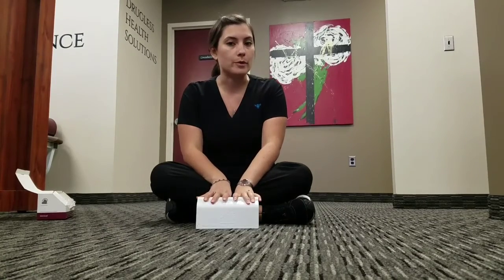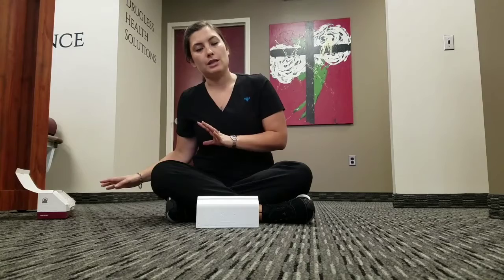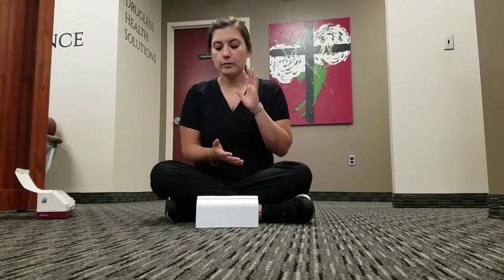One, you want to make sure that you're doing this on the floor. You want to be laying on a hard surface when you're doing this. You do not want to use this on your couch or on your bed. They're too soft and your pillow won't work properly. So make sure you're doing it on the floor. Secondly, when you're laying down, you want your knees to be bent. So you always want to keep your knees bent in order to reduce any pressure or discomfort for your low back. It's important to keep your knees bent.